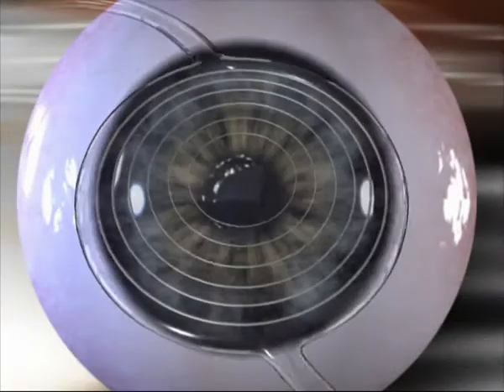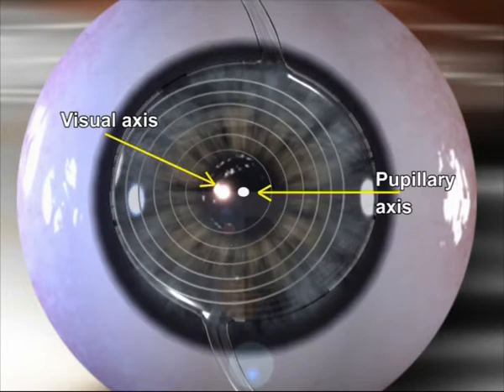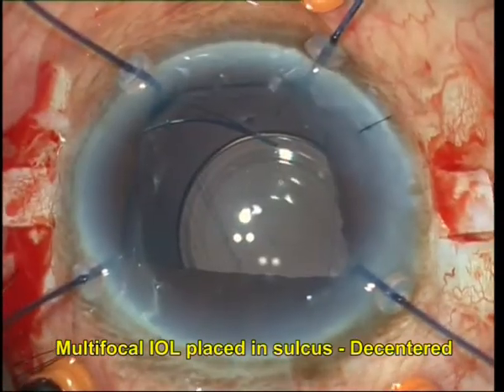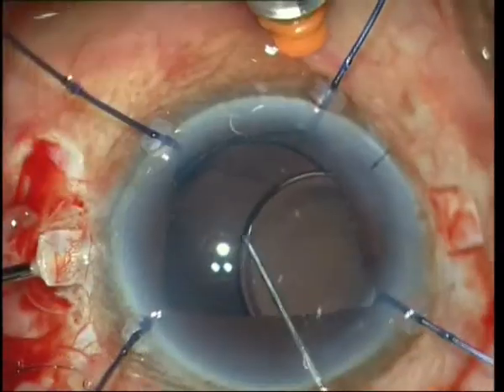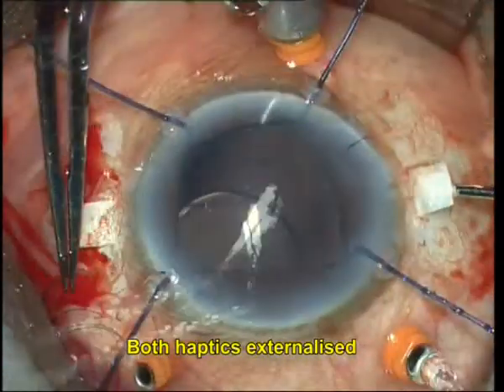Future advances might also include IOL customization to match the angle kappa of the patients, though post-op capsular contraction and IOL rotation would be challenges to be overcome. We are currently undertaking a feasibility study for positioning the central ring of the IOL under the visual axis, and the results may throw more light on this evolving concept.